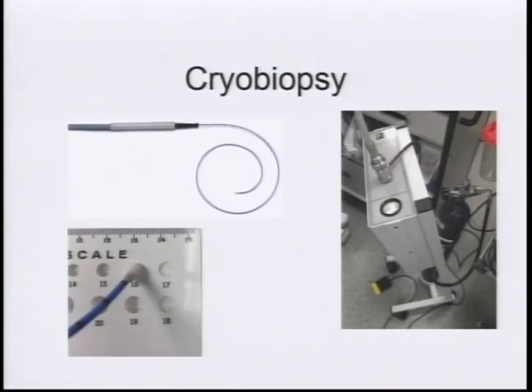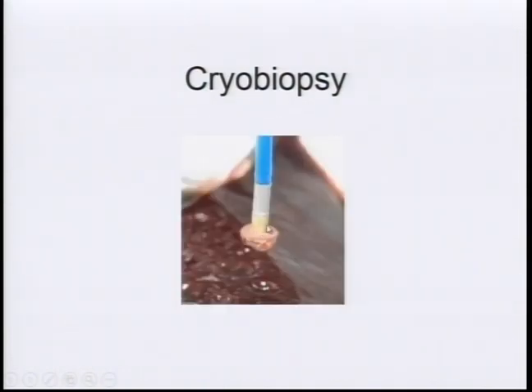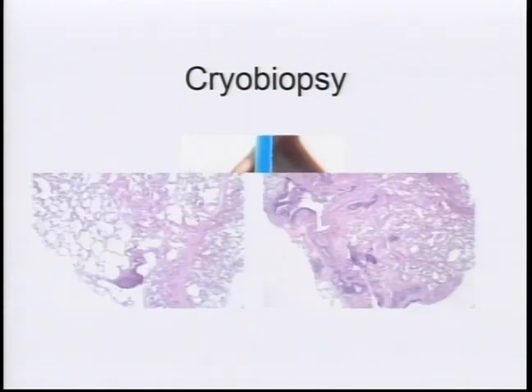in the next few minutes. So cryobiopsies are done with a little flexible probe that goes through the working channel of a bronchoscope. The probe is attached to a tank of CO2, and once you activate the flow of gas through this catheter, the tip of the catheter freezes, and an ice ball forms around it. And when that happens, the surrounding tissue that's in contact with the tip of this catheter gets stuck to it, just much like when you lick a popsicle and your tongue gets stuck to it. So then you pull, and you get a fairly large piece of tissue.